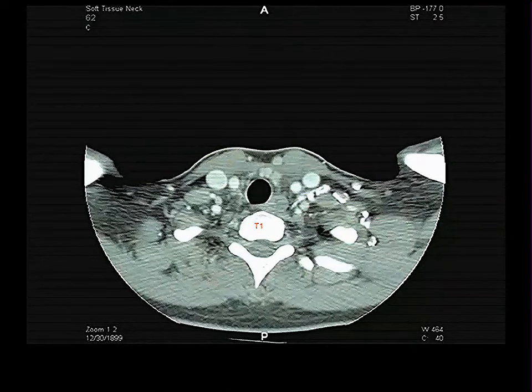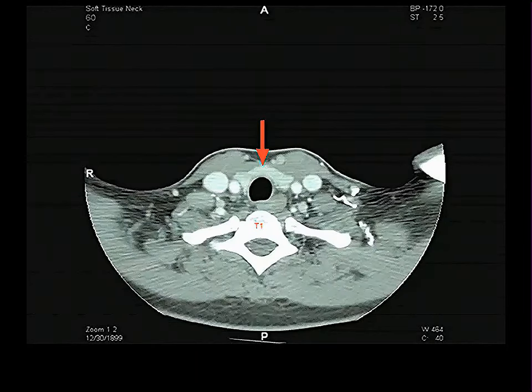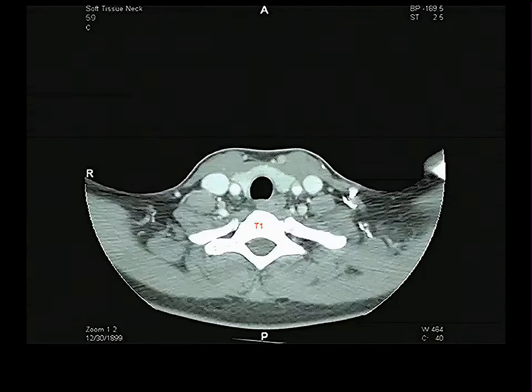Nothing very exciting has happened here. Nothing very exciting. I start to see something right there. All right, well, that's something which crosses anterior to the trachea, clearly the thyroid gland. So that tells us we must be at the 2nd through 4th tracheal rings. We see that the thyroid is here interposed between the common carotid artery and the trachea. So this is the isthmus, but these are the lobes of the thyroid gland. And we keep on going up.